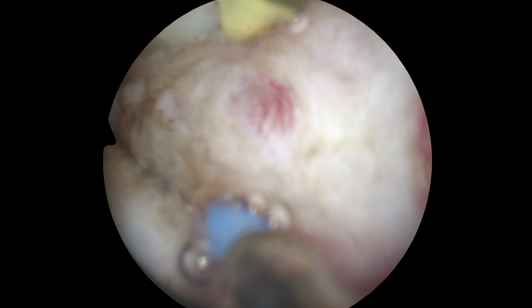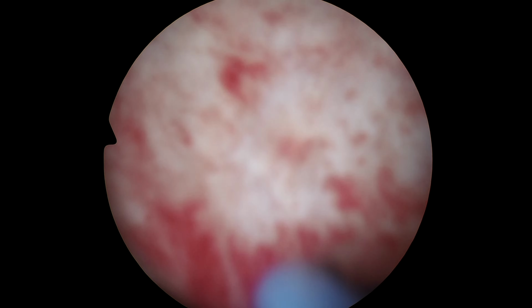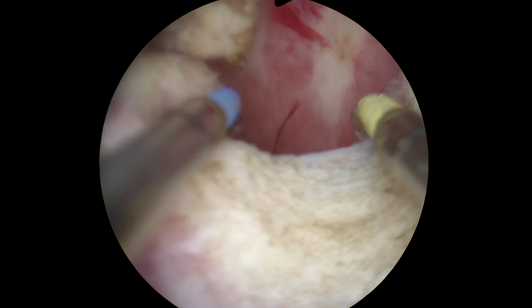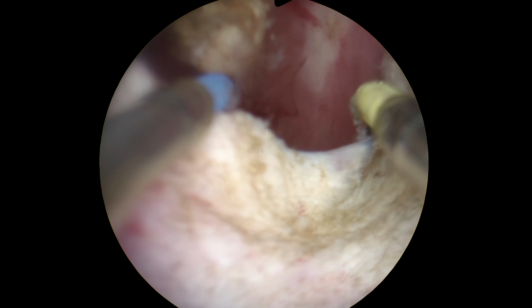So I continue the resection, and in some places I continue the resection laterally to free up space because the fibroid is large and its hanging parts interfere with free work.